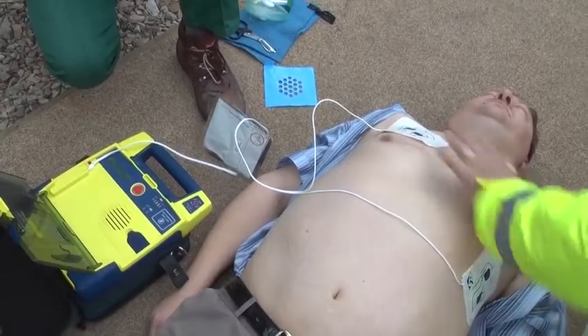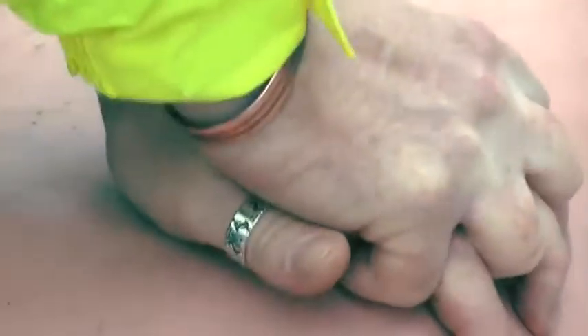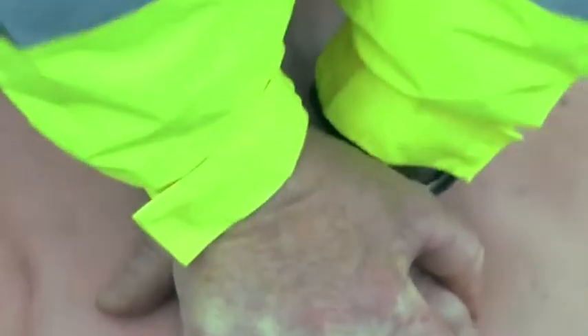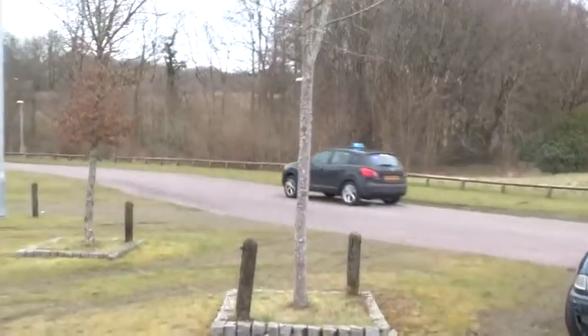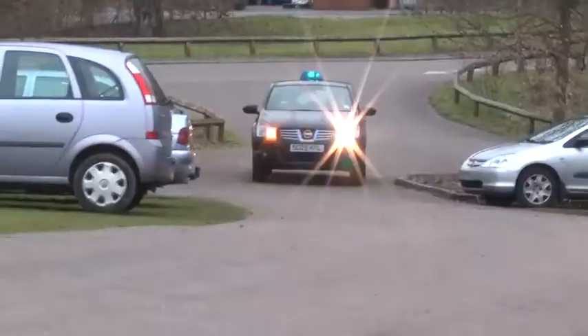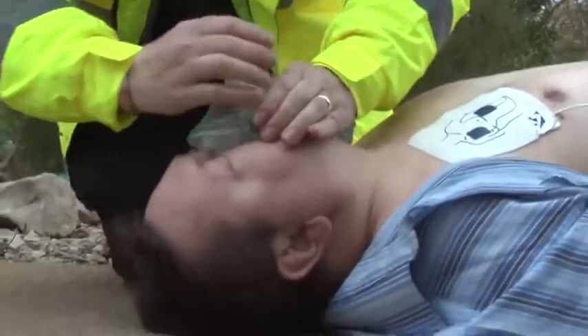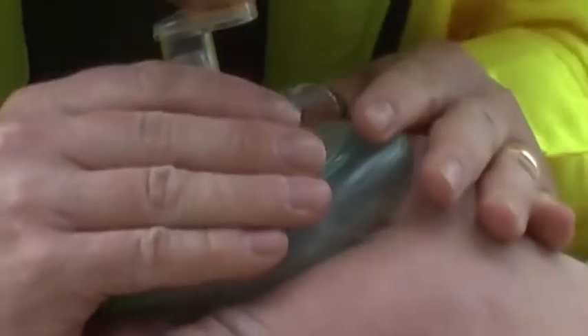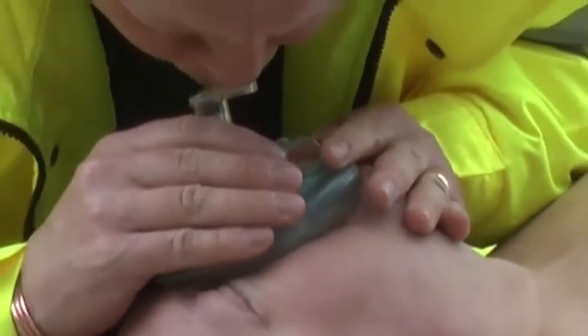Start CPR. Give 30 compressions, then give 2 breaths. Give breath. Give breath. Stop CPR.